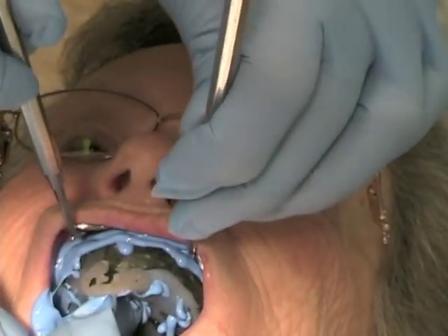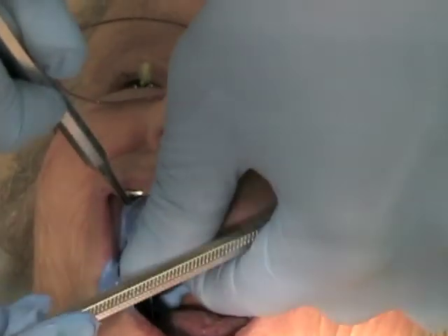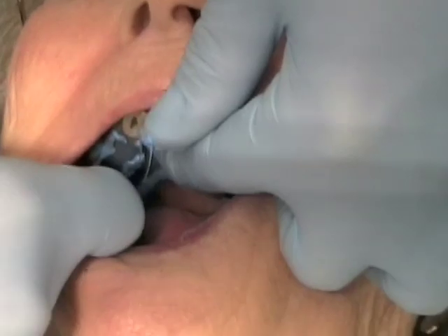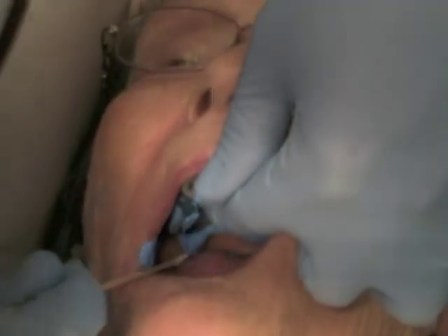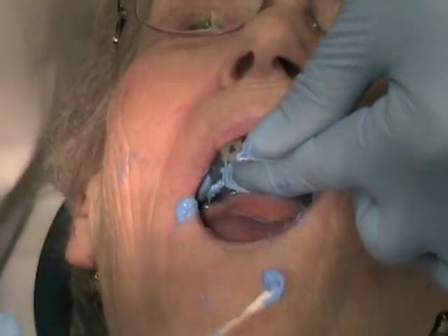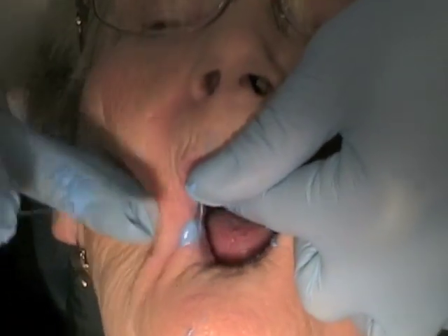Do not remove either mirror until you see a slight excess of impression material come up and over the border of the tray, around the entire periphery and the posterior border of the tray. You should see a slight excess along the entire posterior border. If there is an area without excess, continue to seat the tray until you see such excess.